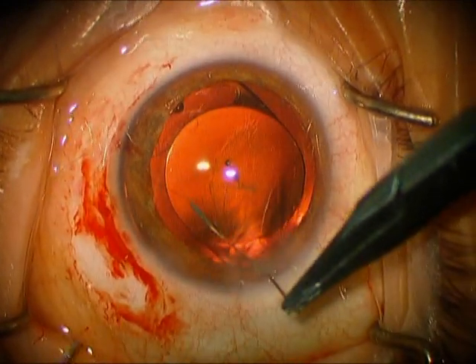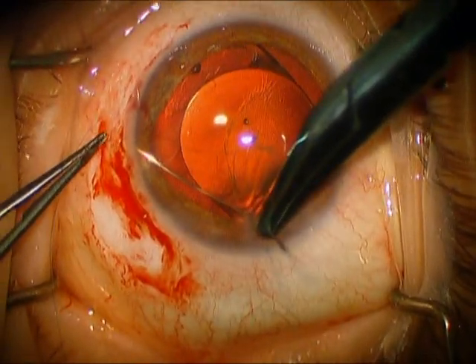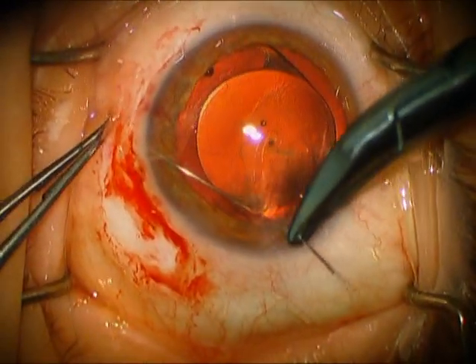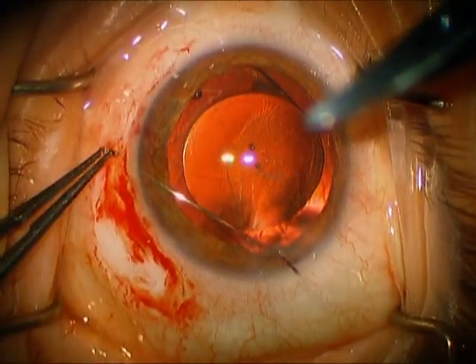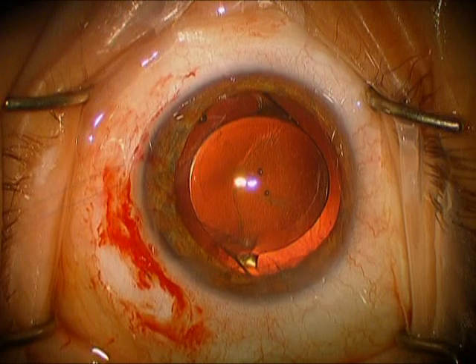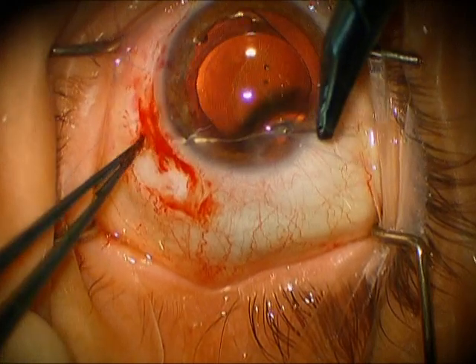You can see that I'm using the 0.12s to separate the cornea clearly there. Once again, we catch a little bit of this iris tissue, and then we place it through the sclera about one and a half millimeters or so back. Sometimes it's hard to catch that little bit of peripheral iris. You don't want to have this suture be too close to the other pass because it's very hard to bury the knot if you get them too close. So we're going to go ahead and place two of these. You can see that the suture passed nicely all the way through the incision so we didn't catch any corneal tissue by mistake.